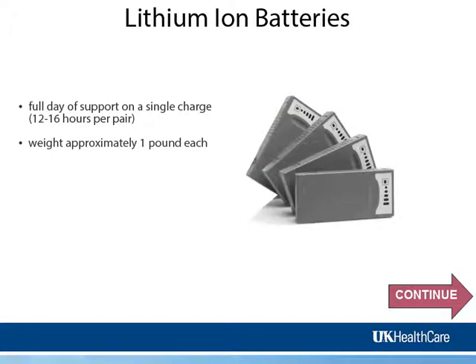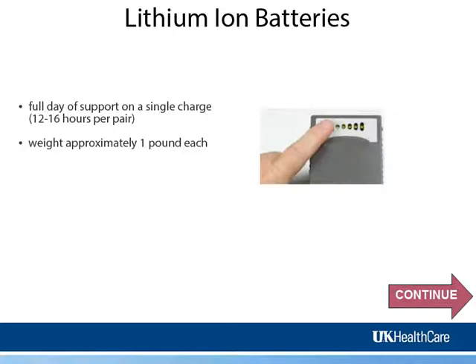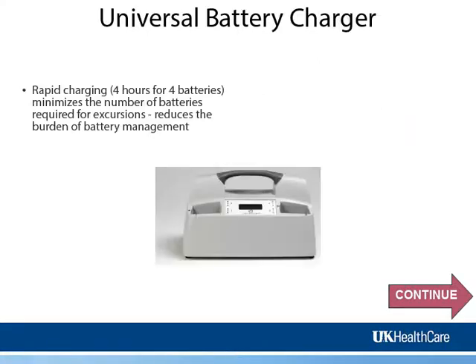Batteries will last for 12 to 16 hours per set, and weigh about 1 pound each. Each battery has a light, which indicates battery charge level. The universal battery charger is a rapid charging system for the lithium-ion batteries. It will fully charge 4 batteries in 4 hours.